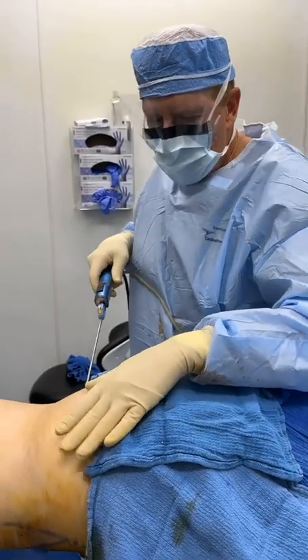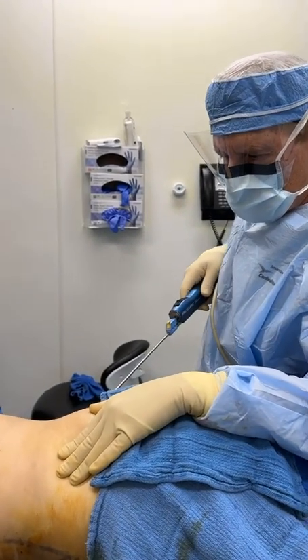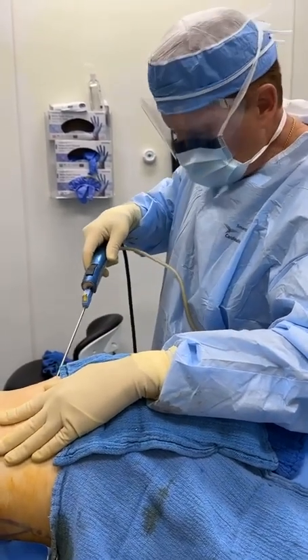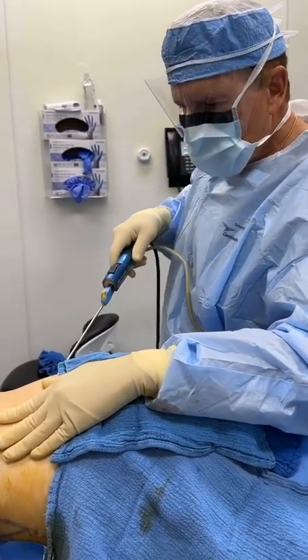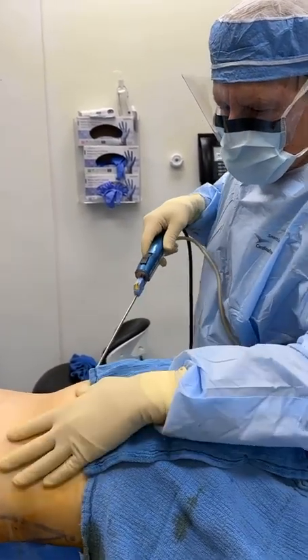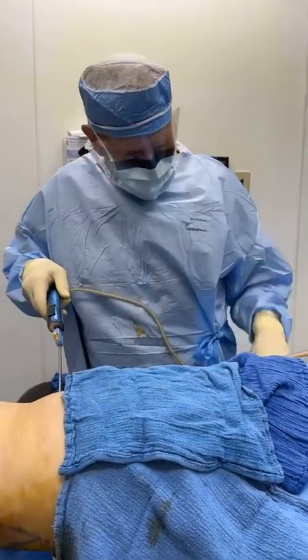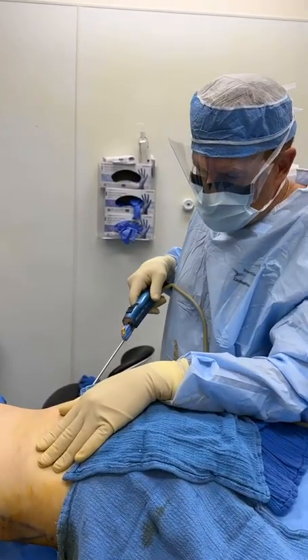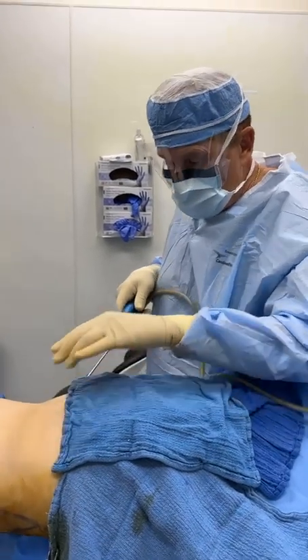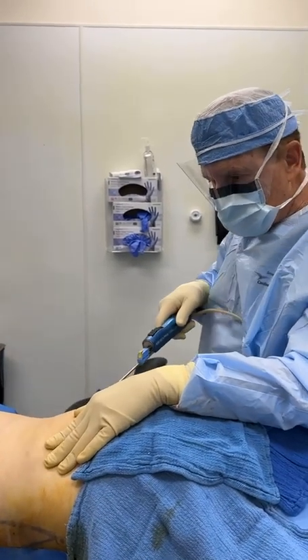And what it does is it also makes it much less likely that we're gonna perforate an internal organ or something, because it's very controlled, it's very slow. I compare this to driving slowly on the road. It's less likely that you're gonna, whoops, find something, right? So we don't want oops. And look at this, look how beautiful. The most important thing is the speed. The speed of the surgeon here is like driving a car, right? That's the most important thing.